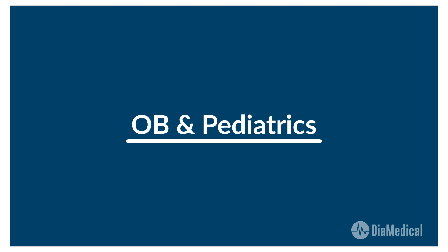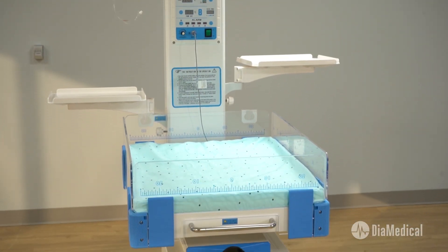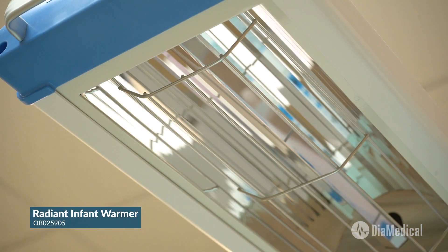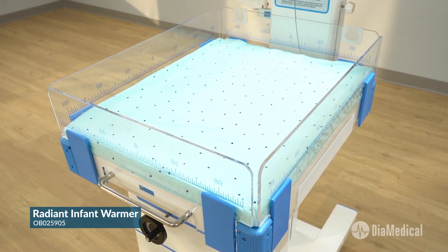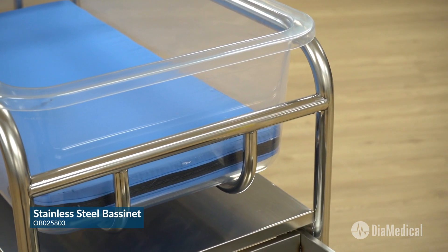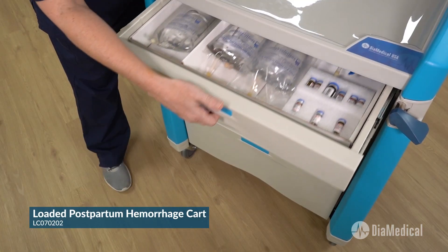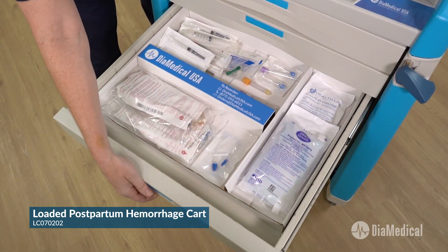Finally, let's explore OB and pediatrics. Maintaining a neutral body temperature is one of the biggest challenges that newborns face after delivery. The Sim Lab Solutions Radiant Infant Warmer features a quartz infrared lamp, a parabolic reflector, three temperature control modes, and an infant bed, just like the ones used in hospital delivery rooms. For healthy newborn care, the Sim Lab Solutions Bassinet is made from polished stainless steel with a drawer for linens and diapers. The Sim Lab Solutions Loaded Postpartum Hemorrhage Cart contains all the supplies and simulated medications needed to teach students how to manage this maternal emergency.